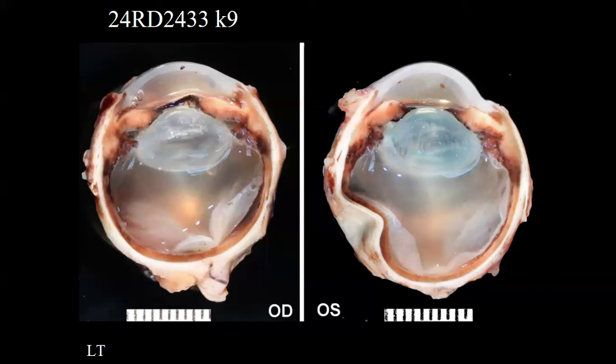From a pathologist's perspective, I think it's important to note that any significant and extensive uveal necrosis can present with fair numbers of melanin-laden macrophages just because the pigment is being released. Yep. So just seeing melanin-laden macrophages alone is not enough to make the diagnosis necessarily. It's also about case presentation, the bilateral versus unilateral distribution of the inflammation, and so on. Excellent point. No finding is an island, I guess.